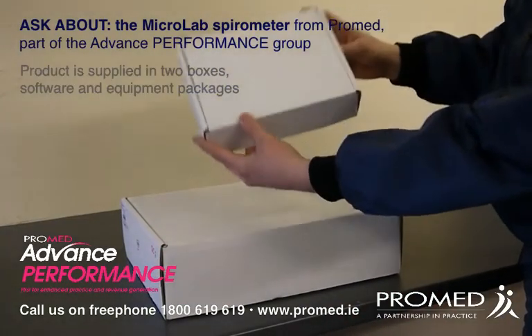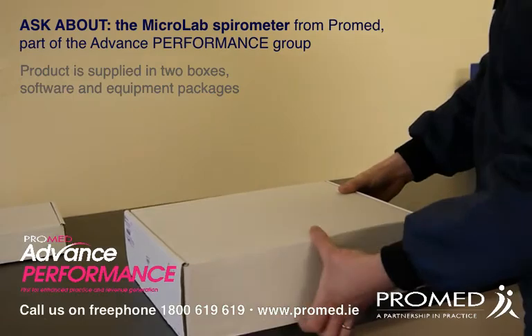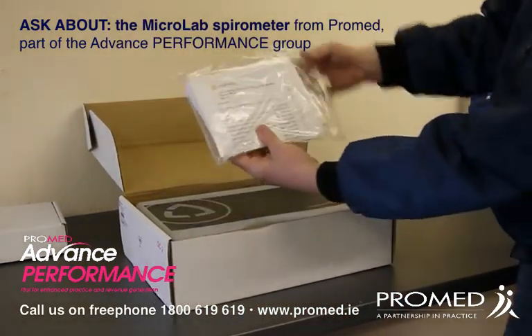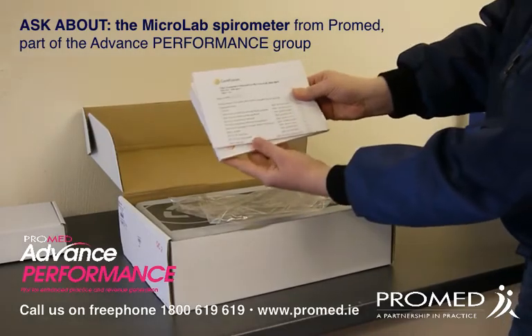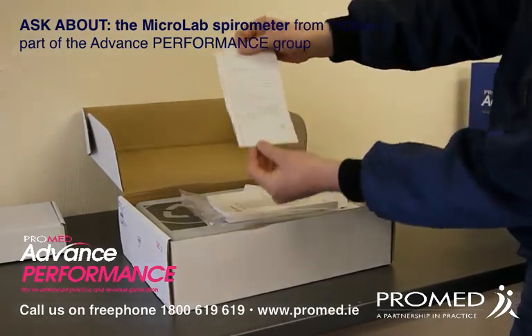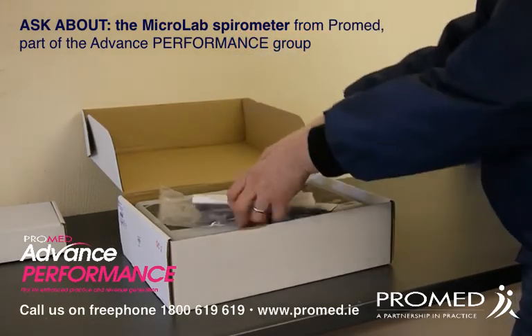If I now unbox your items, you can see you get a software package with it and also a package with the equipment itself. Unboxing this item, you'll see contained within the bag a list of your contents that should be provided with the unit. You'll also see a calibration certificate for your actual unit and testing that was done on it. And you'll see your Microlab user manual.